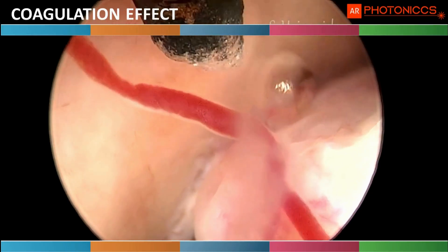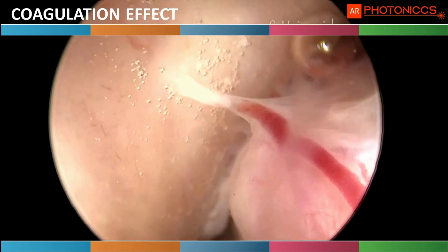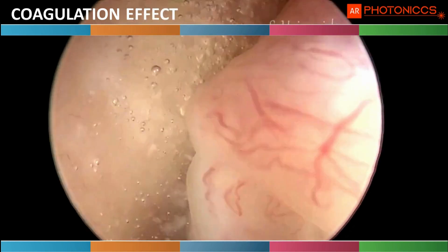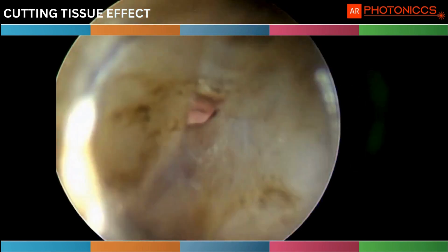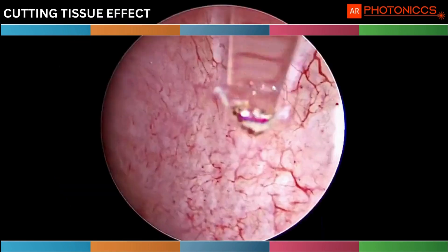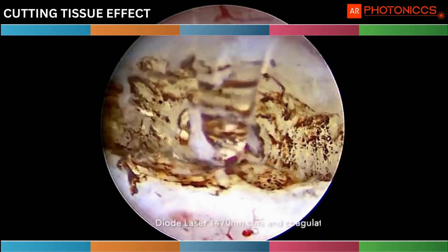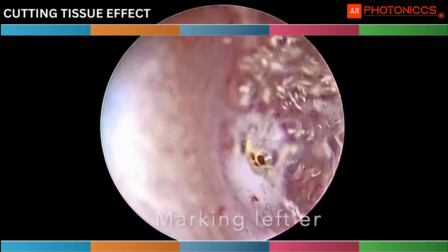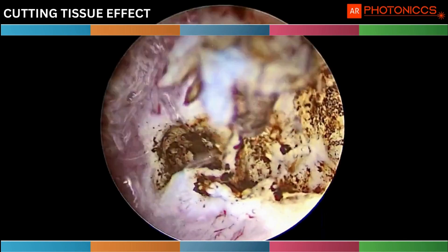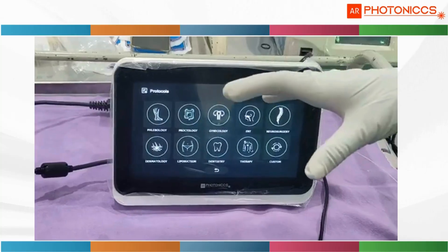These are the indications we use diode laser in hysteroscopy. If you see how it coagulates the vessel — it is not only coagulation, it cuts also. That is the beauty of diode laser: it simultaneously coagulates and cuts. Now you can see how coagulation is happening on bleeding vessels in the hysteroscope. Now you can see the bleeding vessel stop. That is the beauty of 1470 diode laser — you can use it in the hysteroscope and it simultaneously cuts and coagulates, and the bleeding stops.